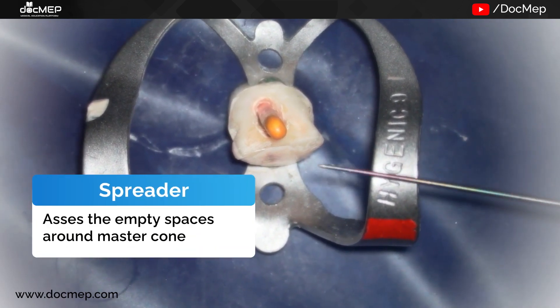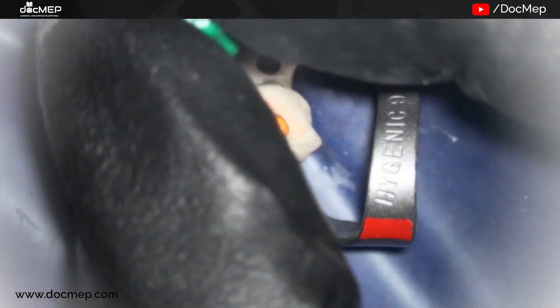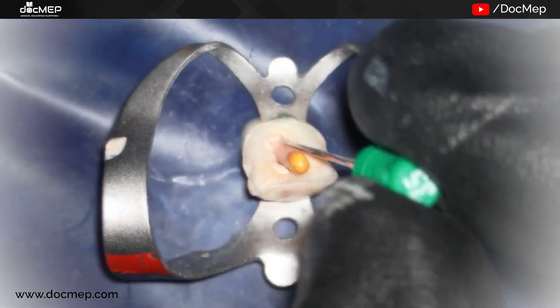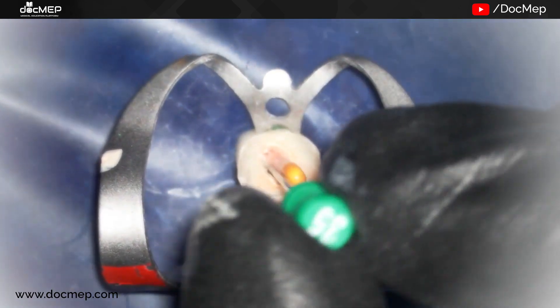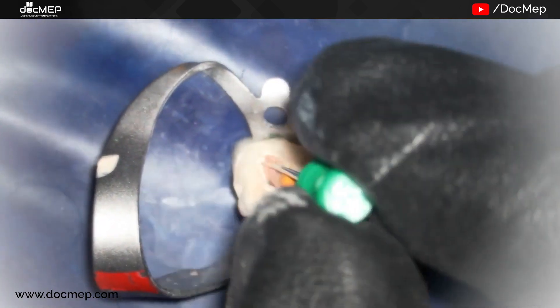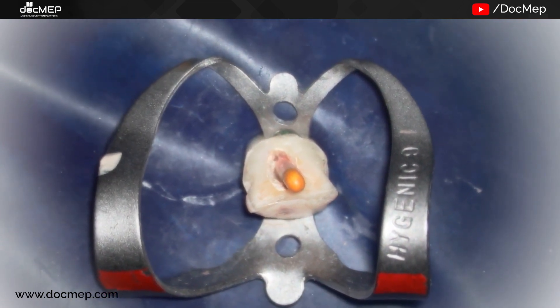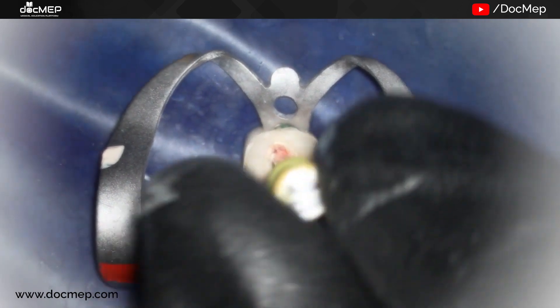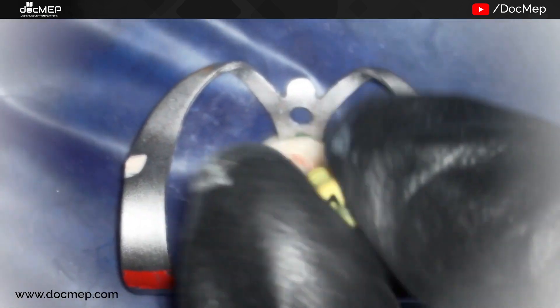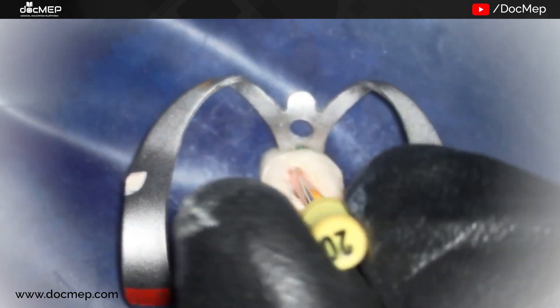If the spreaders go inside easily, that means there are empty spaces which need to be filled by accessory cones — smaller in size and corresponding to the same size as the spreader. As you can see in this video, the spreader is not going in, which means the cone has taken the space completely. We try higher sizes and then smaller sizes as well, making sure there is no empty space around our cone, as these spaces will be foci of infection later. In this video, there are no empty spaces — no spreaders are going inside.